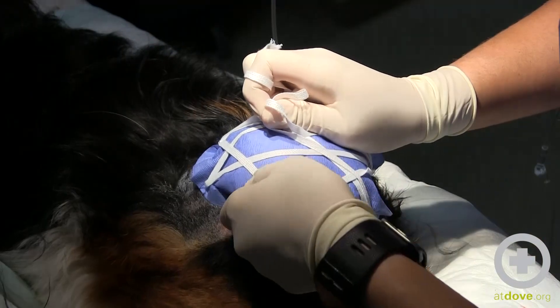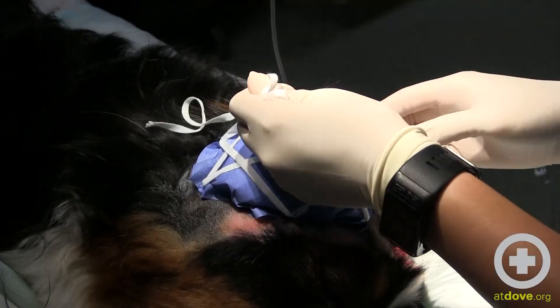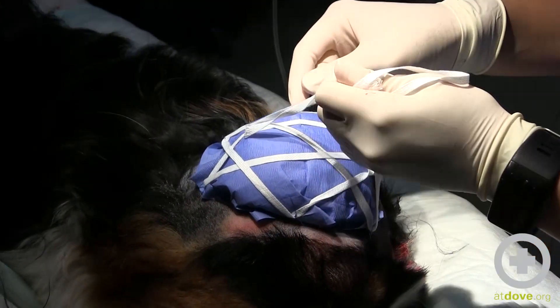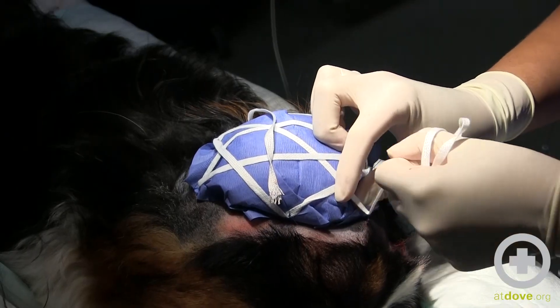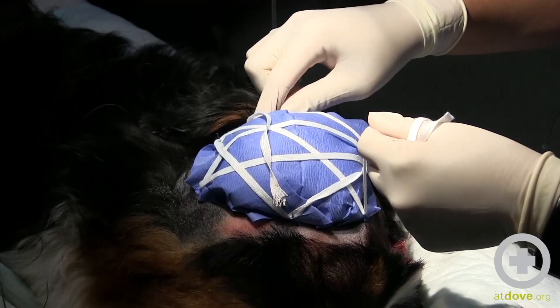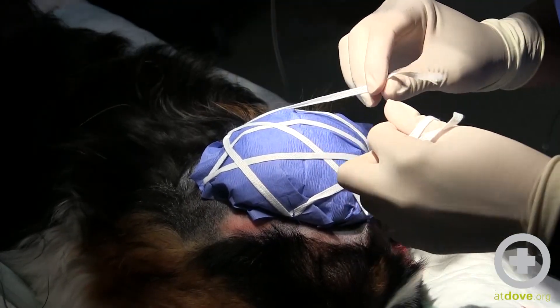That looks pretty good to me. I'm just checking my edges, making sure it feels pretty secured. As I mentioned, I don't have a stay suture on the back end here, and that's because I wanted to avoid irritating her ear. Her ear is pretty close but it's still going to be behind this wrap.